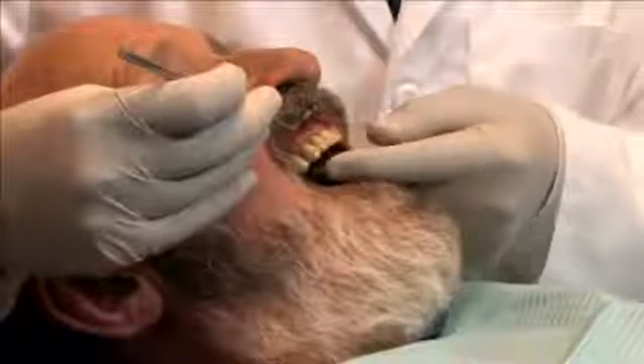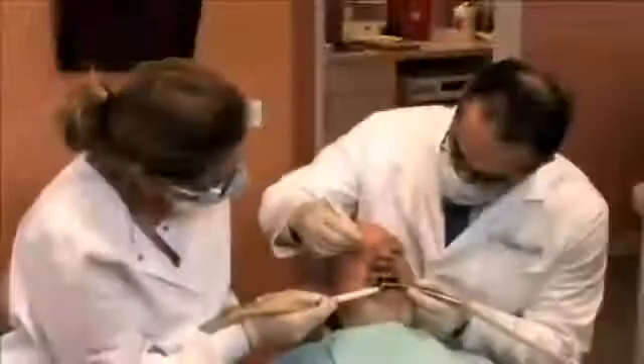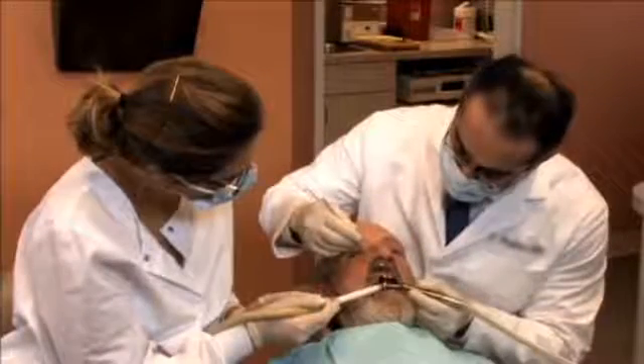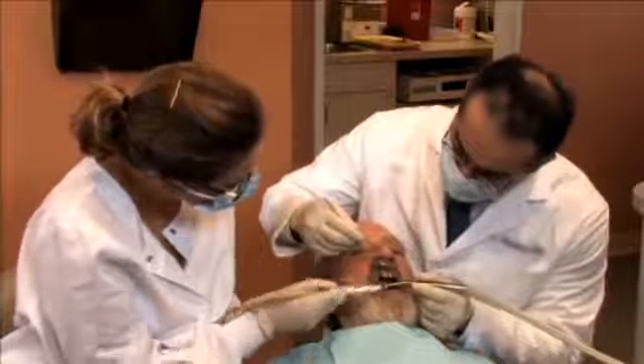Keep in mind, in some instances the bridge received back from the laboratory may not fit as expected. In these cases, your dentist may have to take a second impression or readjust the supporting teeth in order to fabricate a bridge that fits just right.